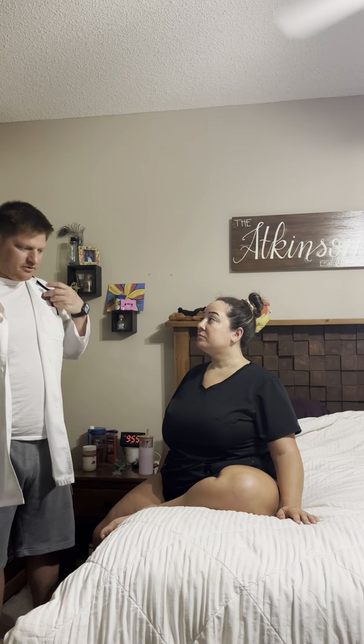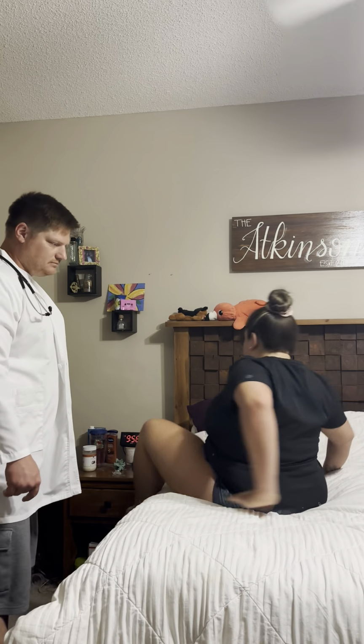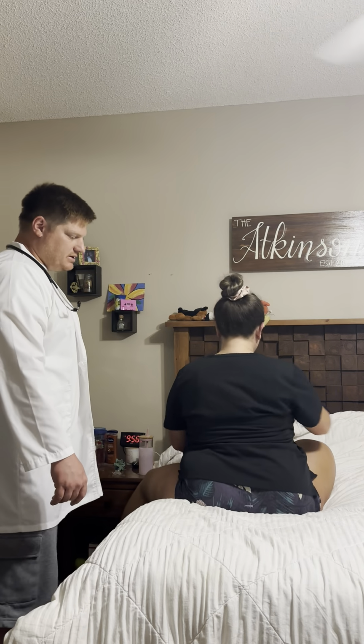Very good. Auscultating, we're listening for rhonchi, rales, wheezing, stridor, pleural friction rub. I don't hear any of those. Everything sounds very good on the anterior surface. With that, I'm going to have you turn around if that's okay and just face the wall here. Thank you so much.